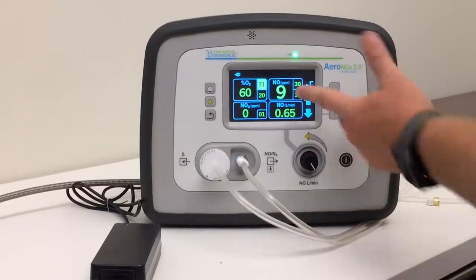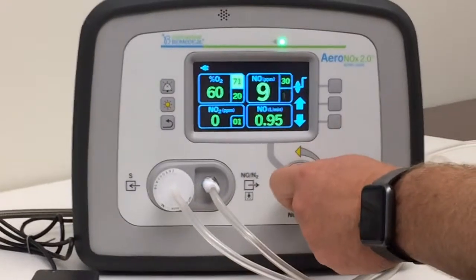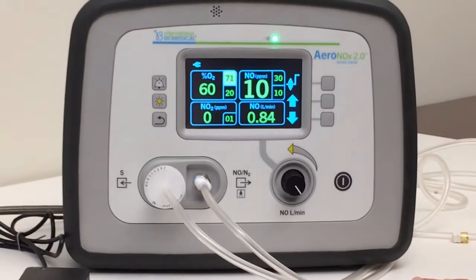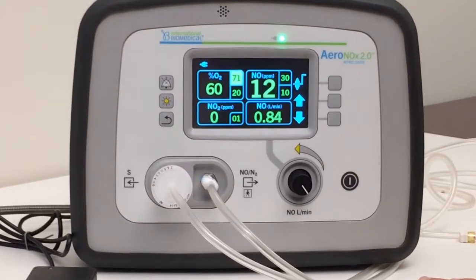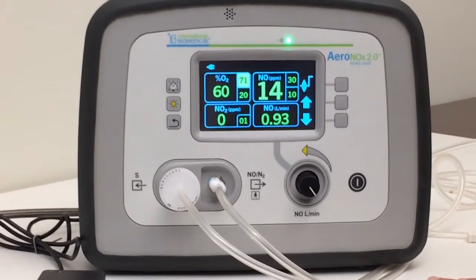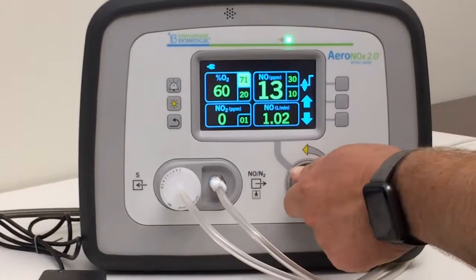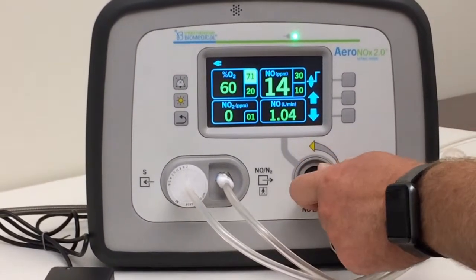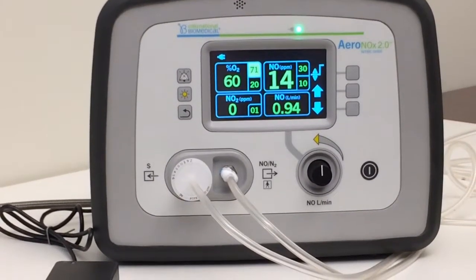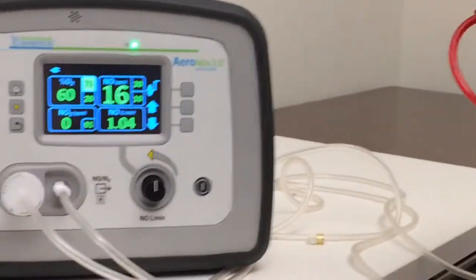So our NO is a little low here — we want to get 20 parts per million, so we're going to go up on this. There's a little lag time on the numbers; fine-tuning is kind of an art, a little goes a long way. You just go up until you get that 20 parts per million. When it's on a test lung it's quite a bit different than on a patient — you've got a little lung here versus the baby's lung. It usually doesn't take more than a liter per minute.